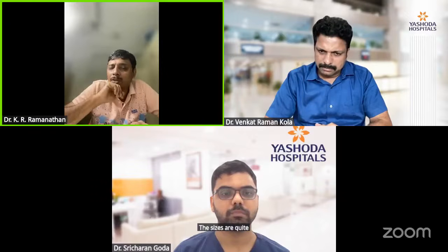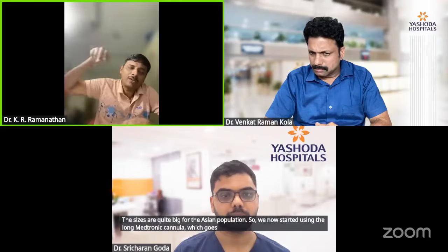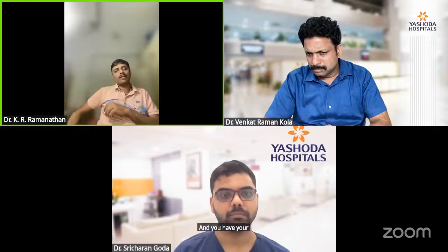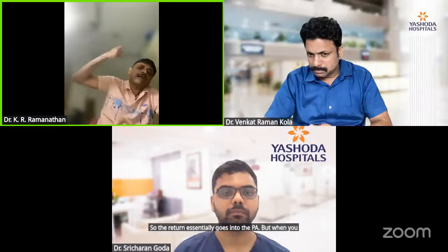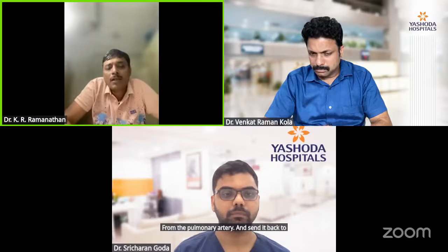as well as the sizes are quite big for the Asian population. So we now started using the long Medtronic cannula, which goes into the PA. So it gets guided into the PA, and you have your other venous drainage happening from the groin. So return essentially goes into the PA. But when you use PAVA, it will be the other way around. You will drain it from the pulmonary artery and send it back to the femoral artery.